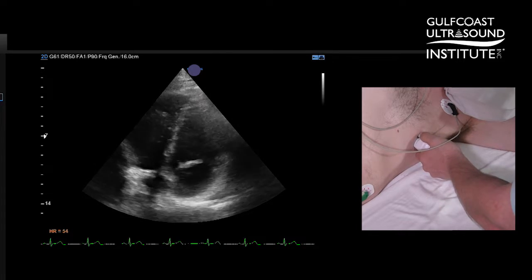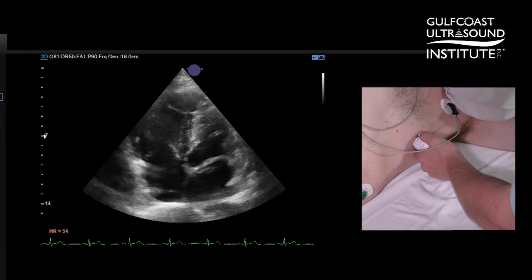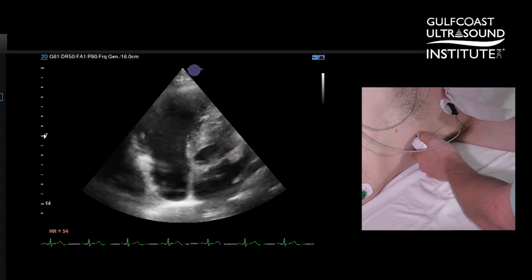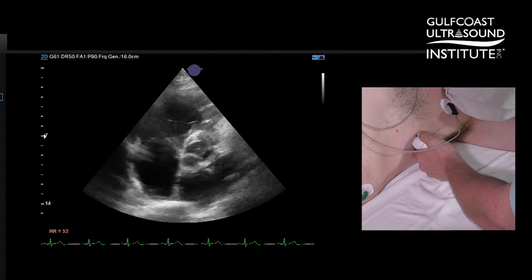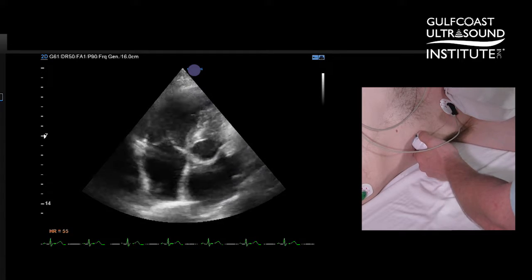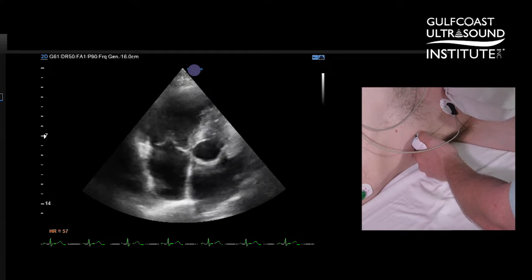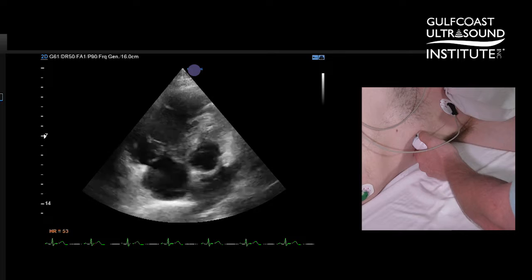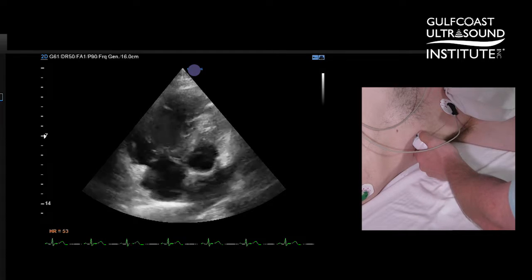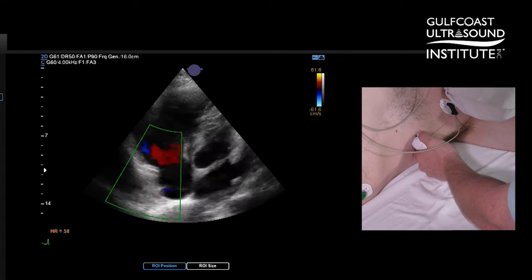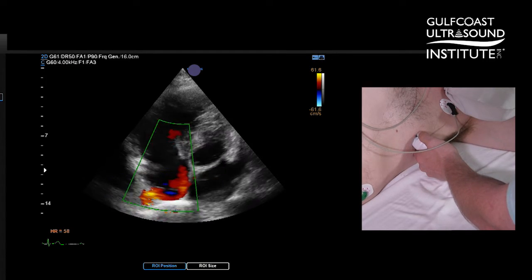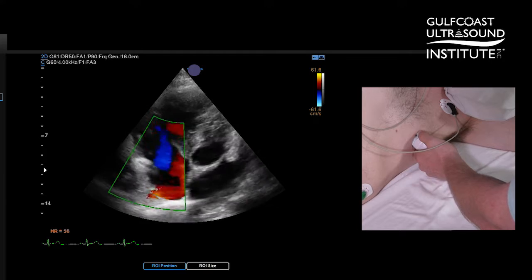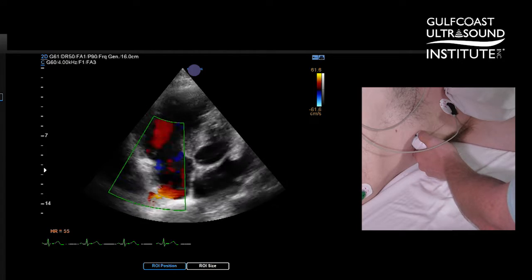This is very rounded out, but to bring in the tricuspid valve we can see that the image is slightly clearer here. We have better contact. I'm going to put color on, and here we can magically see that there is a little bit of a TR jet.